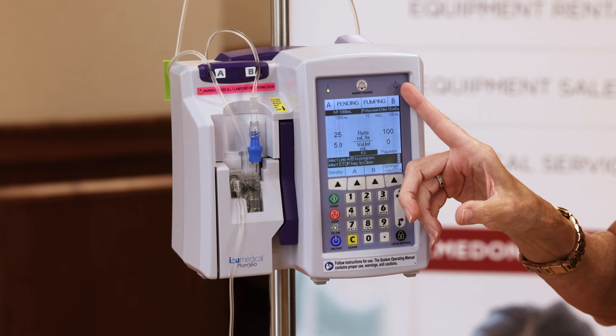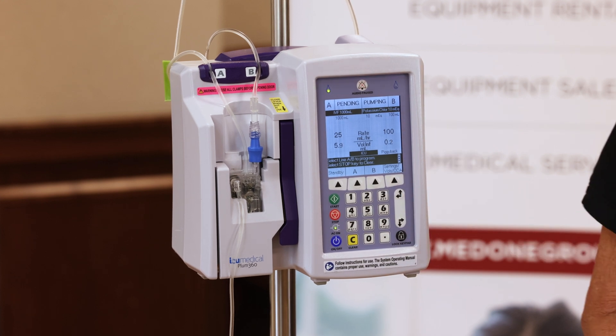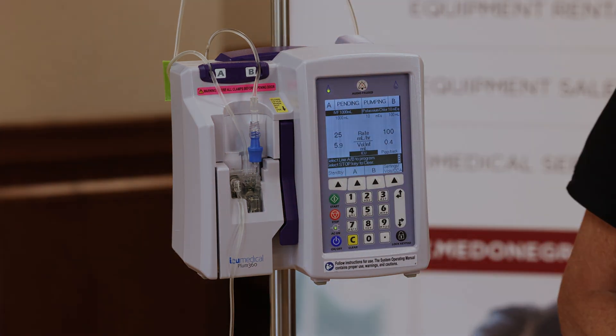Now you can see the flow indicator on B is blinking. And because it's in piggyback mode, line A is in standby until our potassium infusion is completed.